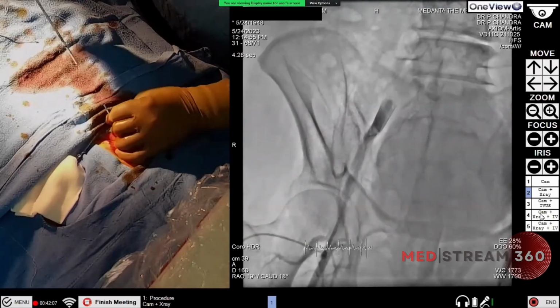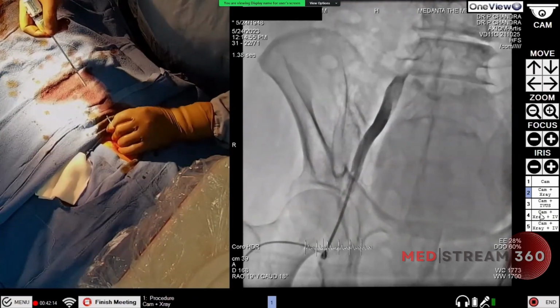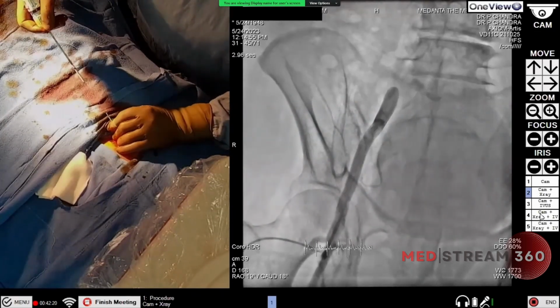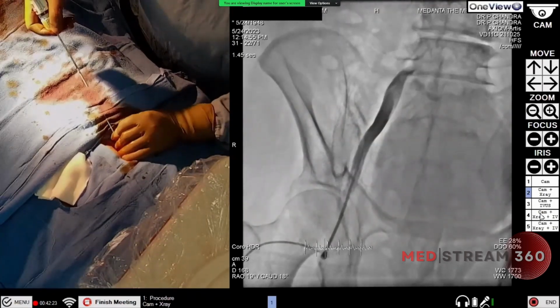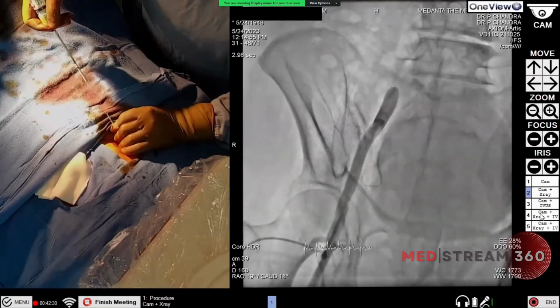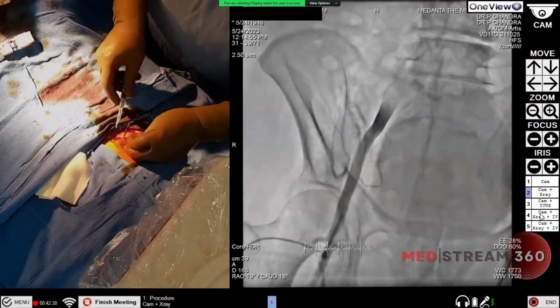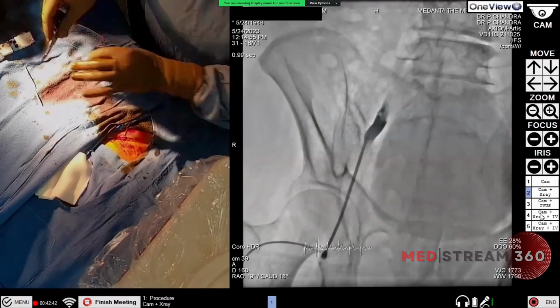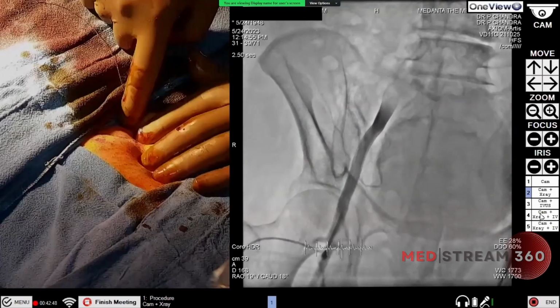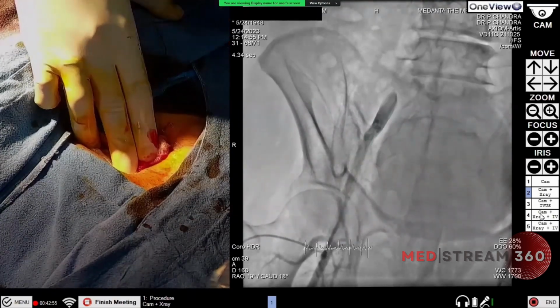So this was to emphasize the fact that in patients who have previous history of bypass surgery and multiple interventions, one should start thinking that these patients might be having a calcification, and a CT image is also very important. We should take that into consideration before planning a case like this, because many times on routine angiograms we don't see that much calcium, but when we start doing the procedure, then we are stuck in between. So here you can see that there is no bleeding, nothing, everything is okay. That's all. So with this, thank you very much, and we'll see you again.